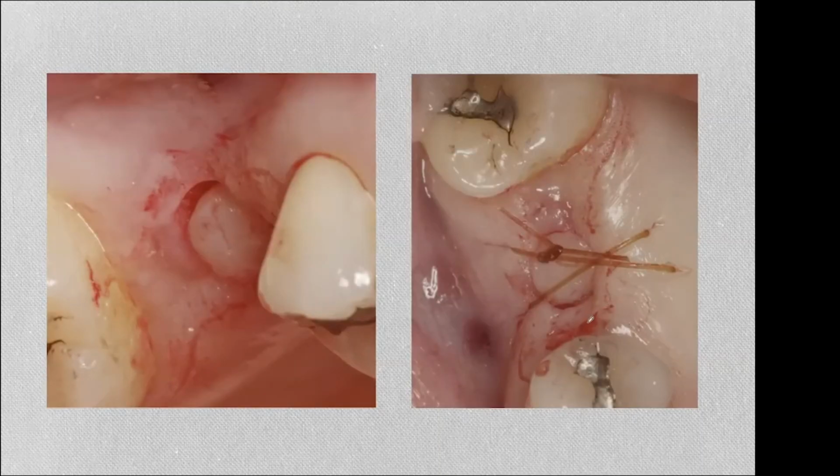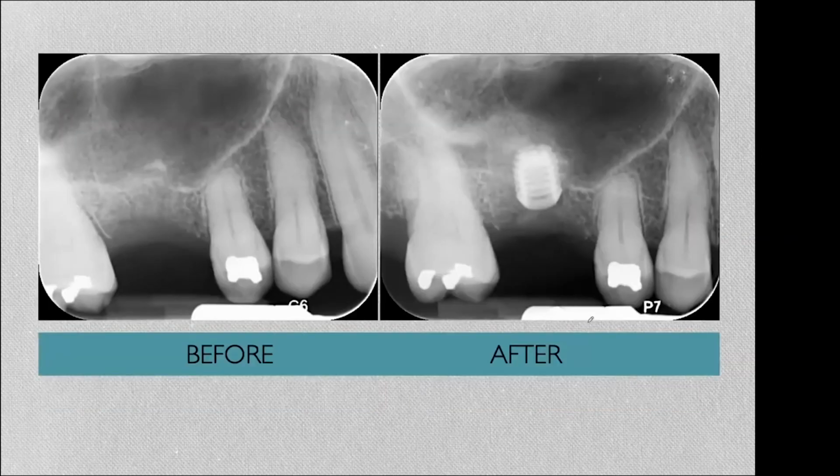You could obviously open a flap if you don't want to use a punch. You could also, if you lose this for any reason or you don't like it, just use a collagen plug. If you're not going to use the gingiva, I suggest you do a flap and retract it fully to one side so it doesn't interfere with your guide. But the procedure took minutes. Here's the result in the end. That's before, this is after. And this I found in a case where the bone was not clear. Even on a cone beam scan, as you saw, it wasn't very well defined.